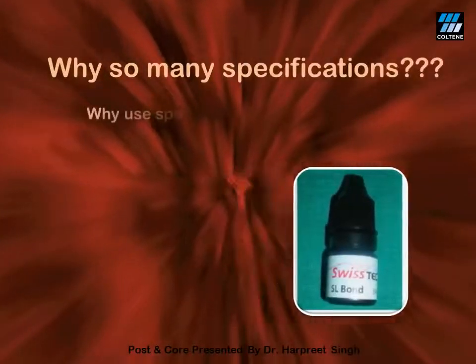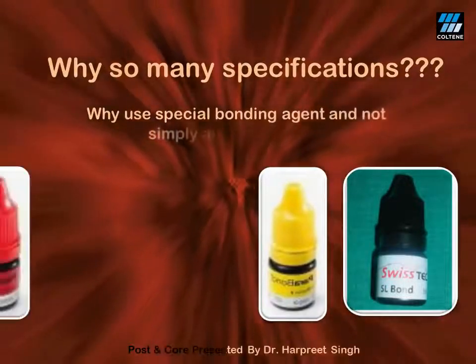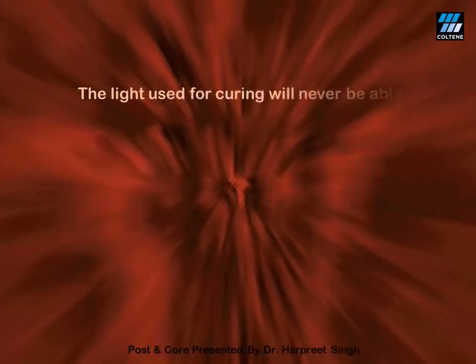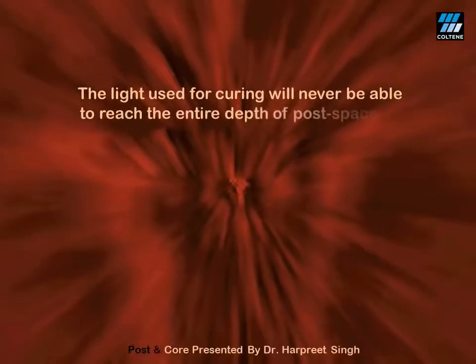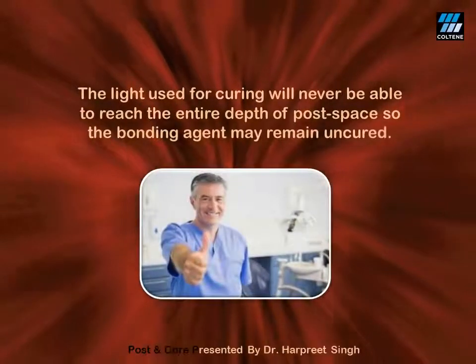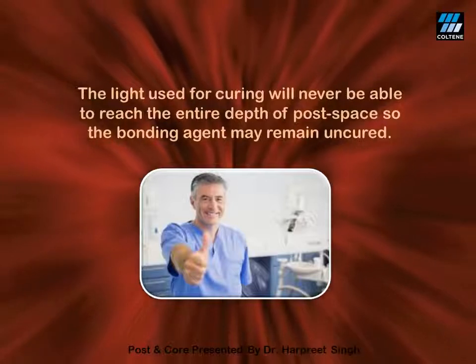The next question is: why can't I use a conventional dentine bonding agent? Why use a special chemically cured bonding agent? The answer is that if you use a conventional dentine bonding agent in the post space and then cure it with your LED, the light will never be able to reach the entire depth of the post space, and thus the bonding agent in the deepest part will stay uncured. This would eventually lead to failure of your restoration. Therefore, I use a chemically cured bonding agent which does not need light for its activation.